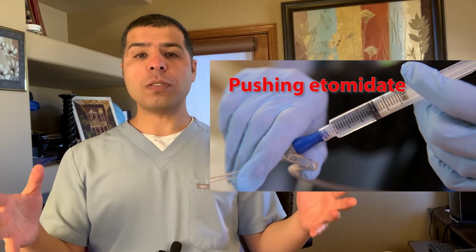Now, if the patient remains awake or inadequately sedated despite pushing the sedative, let's say in this case, I pushed etomidate 0.3 milligram per kg. What do you do?